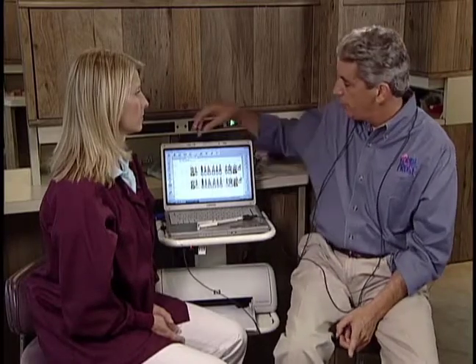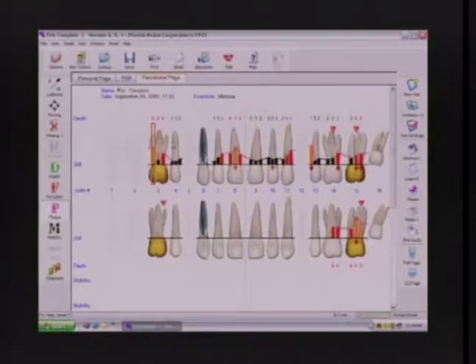You're going to do exactly the same exam that you've always done with plaque. Whether you disclose, or you're going through with just a scaler or explorer and checking for plaque, you're simply using the foot pedal to record the presence of plaque. So quick taps advance, very consistent, hold and listen. Black, black, black.